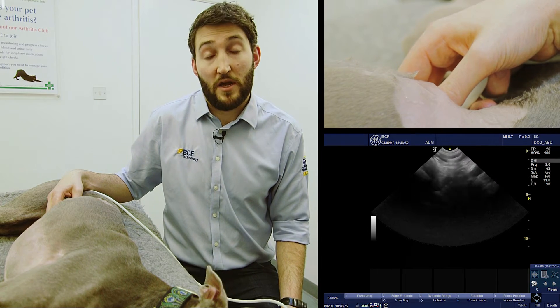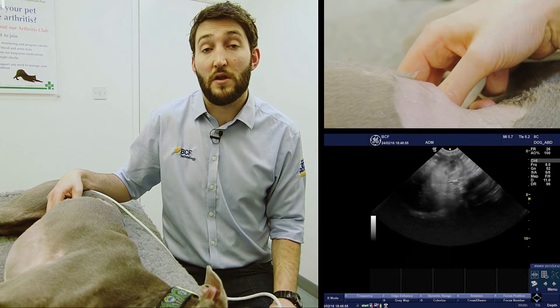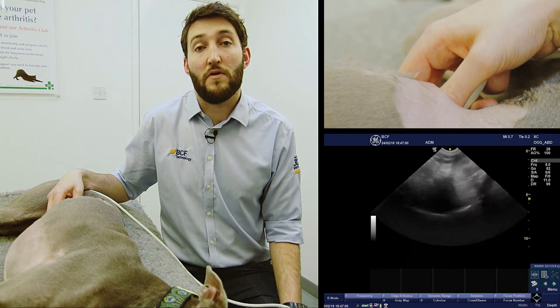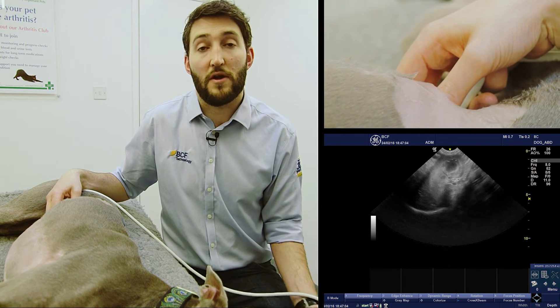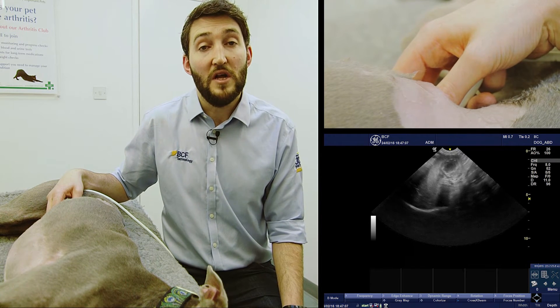In this video we're going to take a look at how to scan the right adrenal gland. The right adrenal gland lies between the right kidney and the vena cava. Remember that the aorta lies to the left of the body in the dorsal abdomen and the vena cava lies to the right, so the right kidney is adjacent to the vena cava and the left kidney was adjacent to the aorta.